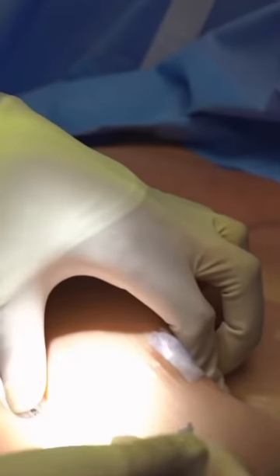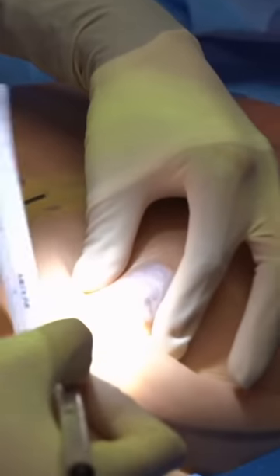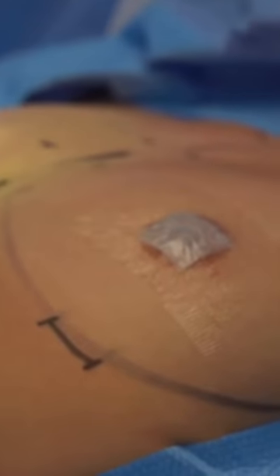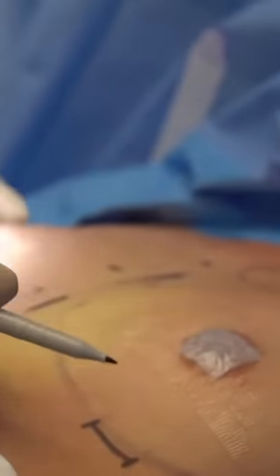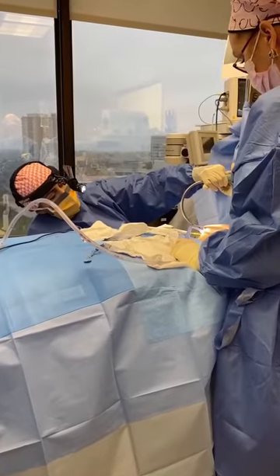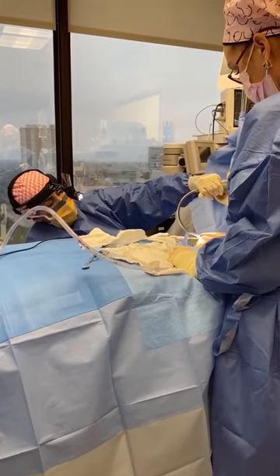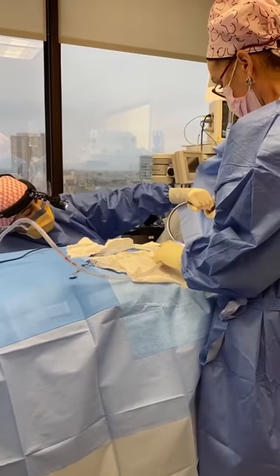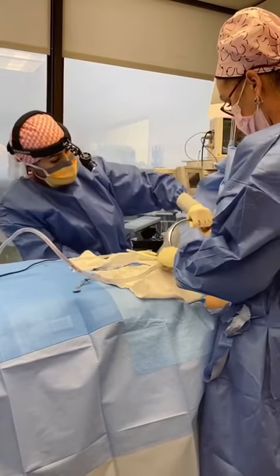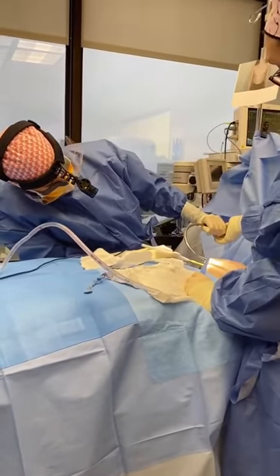I'm re-confirming my marks. I like to check the fold one more time and make sure the distances are nice and even to confirm she's symmetric, placed in the perfect position right in her fold so she won't have to see them. The special technique we use means we don't use any drains and we don't wrap our patients — they just go home in a fancy surgical bra and have a really quick, fast recovery.